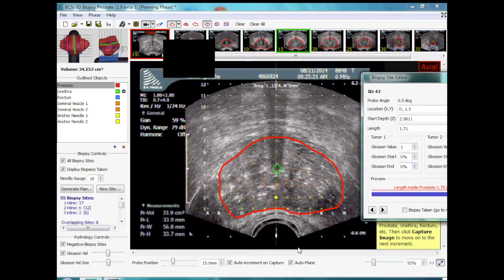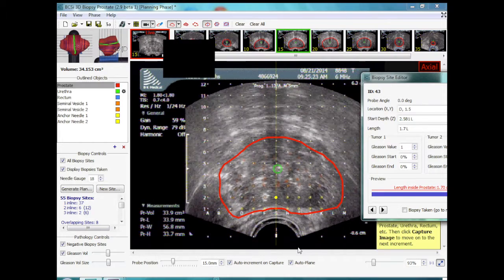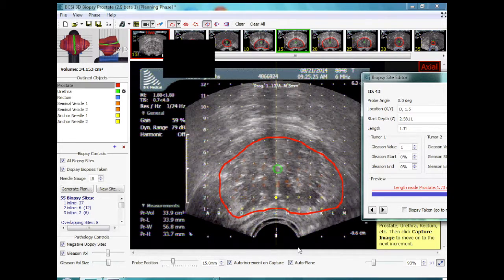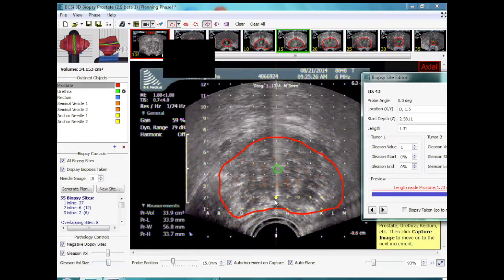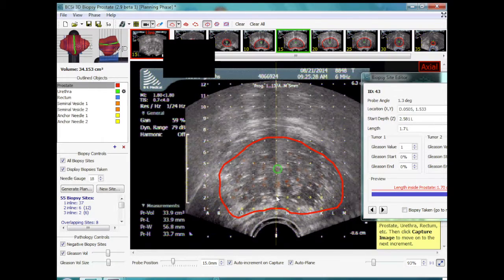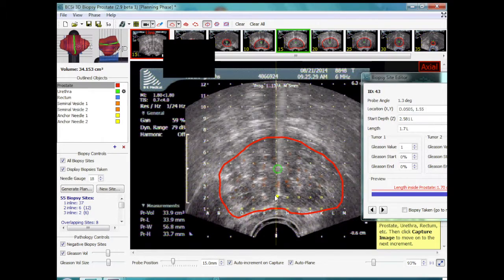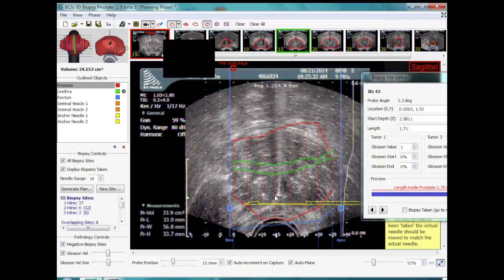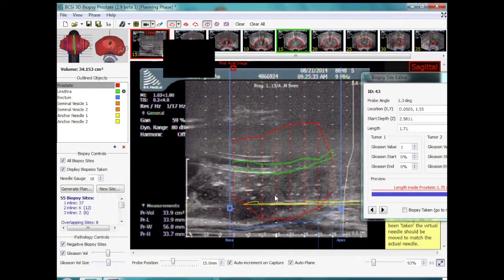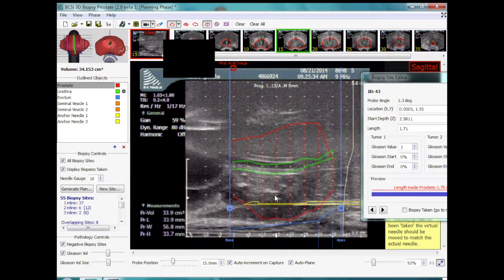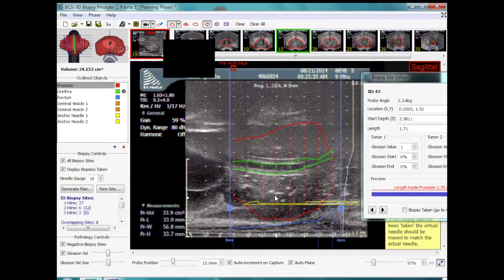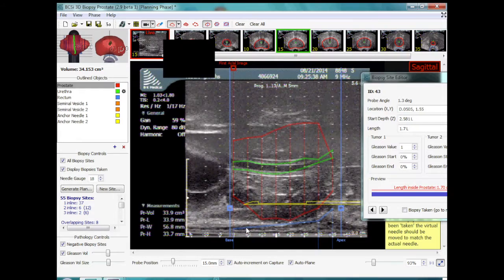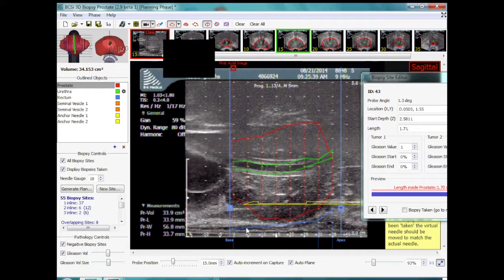A midline posterior biopsy is to be taken underneath the urethra. The needle is inserted in the intended target position and the probe is then switched to sagittal imaging. This midline position shows the virtual and the actual urethral line above the biopsy needle.